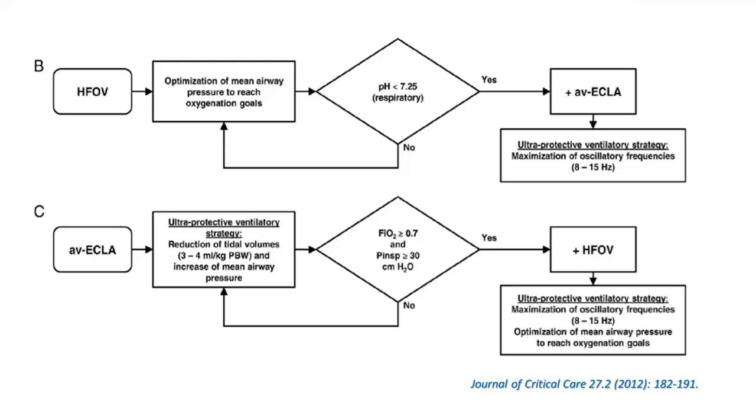Yeah, thank you so much, guys, for giving me the chance. First, I would like to thank Dr. Haitham. It's well prepared, with very simplified physiology. Thanks to the group for bringing this talk on cardiac ICU. Yes, we less frequently utilize high frequency. Personally, I probably just use it for a few cases. I use the Dräger for that.